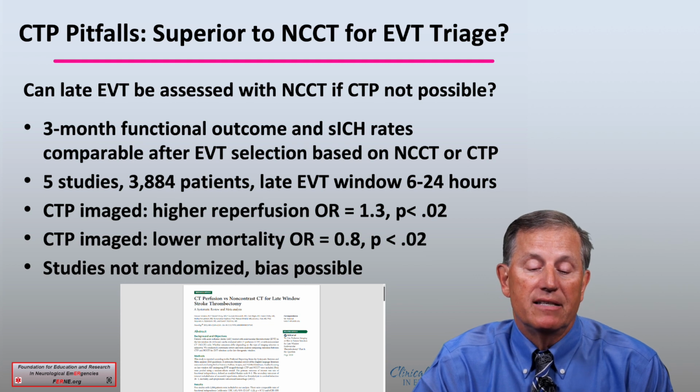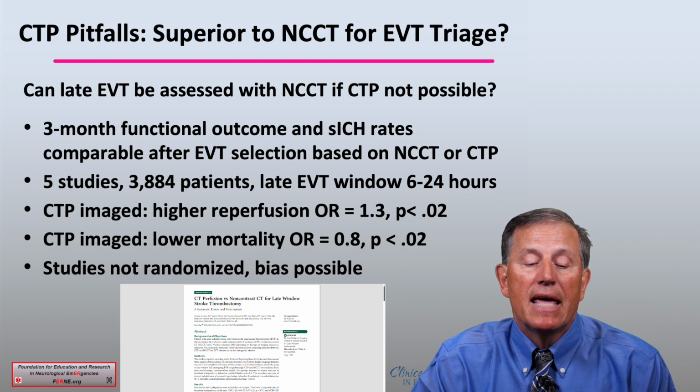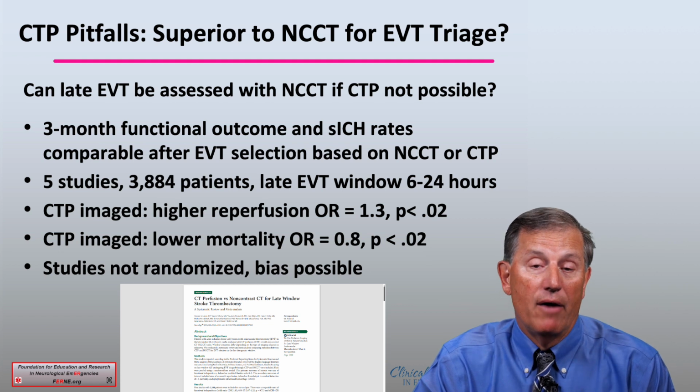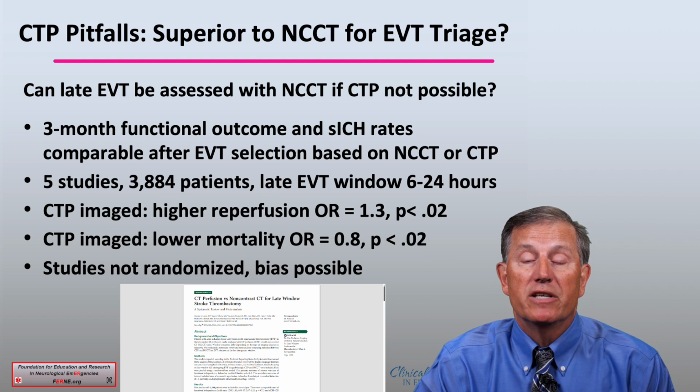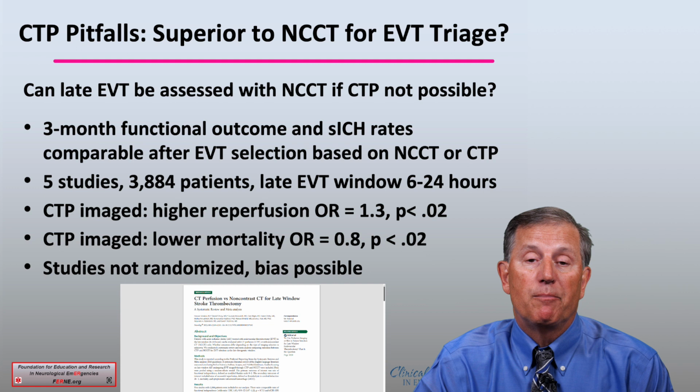Odds ratios listed here. What this suggests is that if you do use CT perfusion, you are more likely to have higher reperfusion and lower mortality when referring for EVT. However, it is still possible to refer for EVT using a non-contrast CT alone if you do not have CT perfusion available in your center.